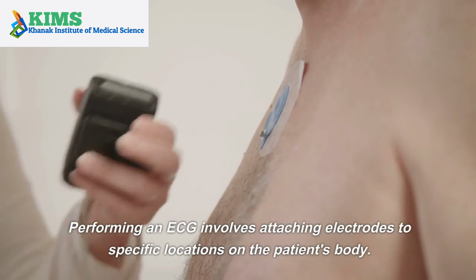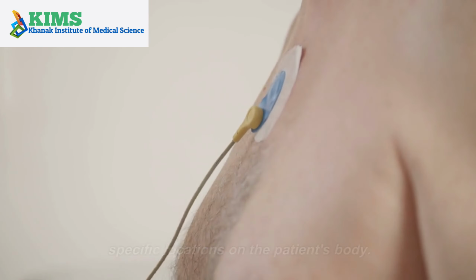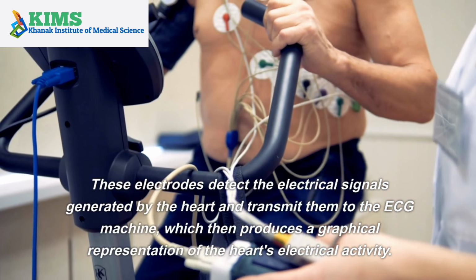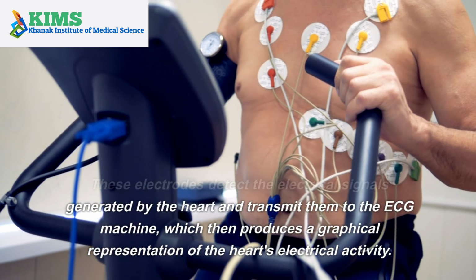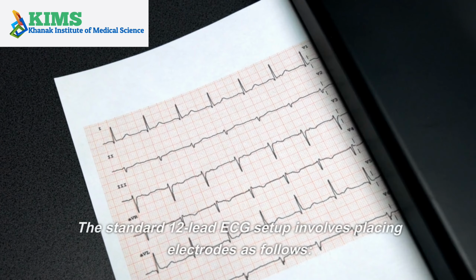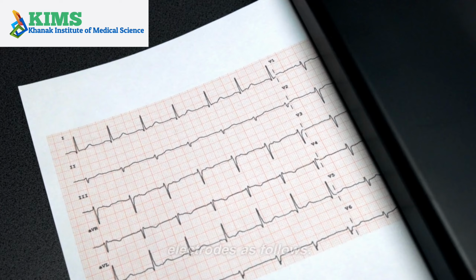Performing an ECG involves attaching electrodes to specific locations on the patient's body. These electrodes detect the electrical signals generated by the heart and transmit them to the ECG machine, which then produces a graphical representation of the heart's electrical activity. The standard 12-lead ECG setup involves placing electrodes as follows.